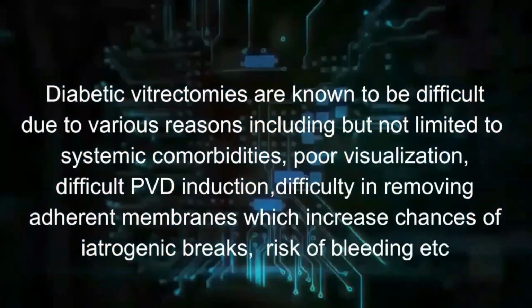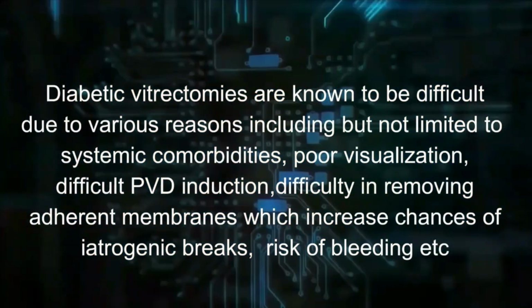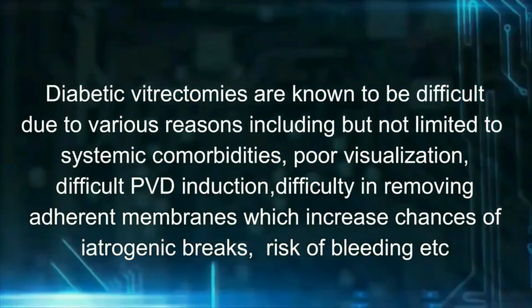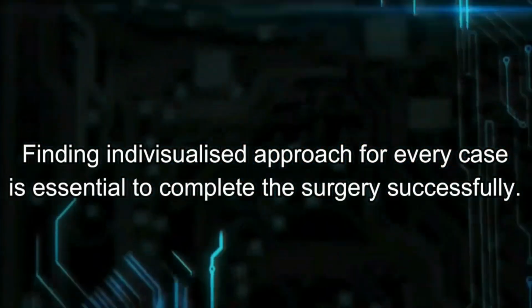Diabetic vitrectomies are known to be difficult due to various reasons, including systemic comorbidities, poor visualization, difficult PVD induction, difficulty in removing membranes, and increased risk of bleeding. Finding an individualized approach for each case is essential to complete the surgery successfully.